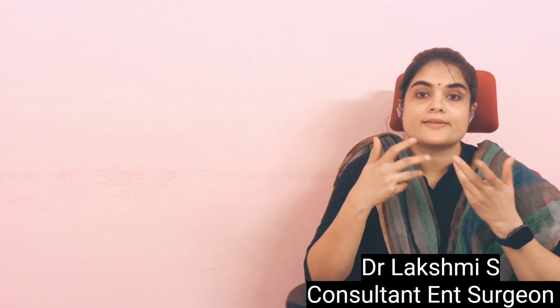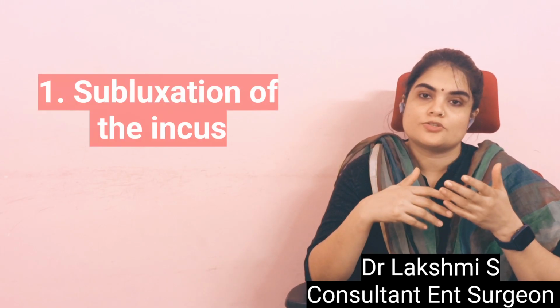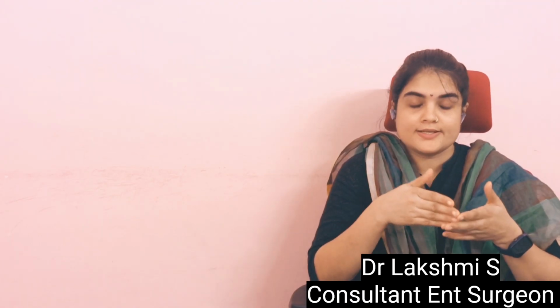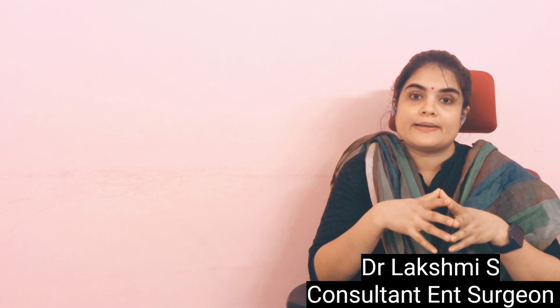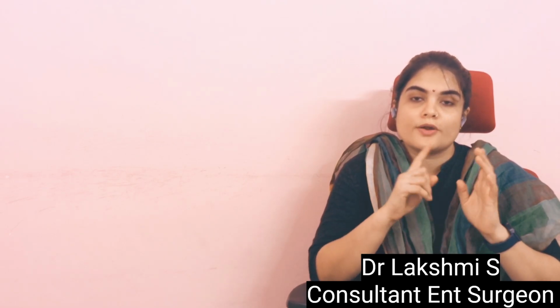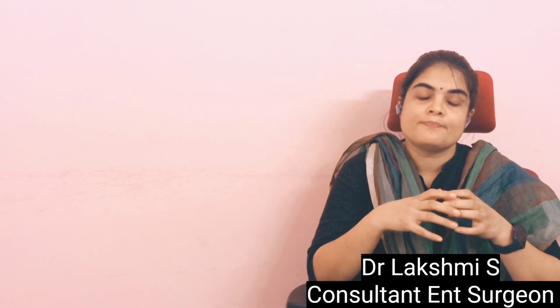One is subluxation of the incus. This can happen while you curette or while you dislocate the incudostapedial joint. The incus can be subluxated. If a small subluxation is there, we can proceed with the surgery, but it will be difficult to crimp the prosthesis onto the subluxated incus. But if the incus is fully dislocated, we'll have to use a prosthesis that can be fixed to the malleus.